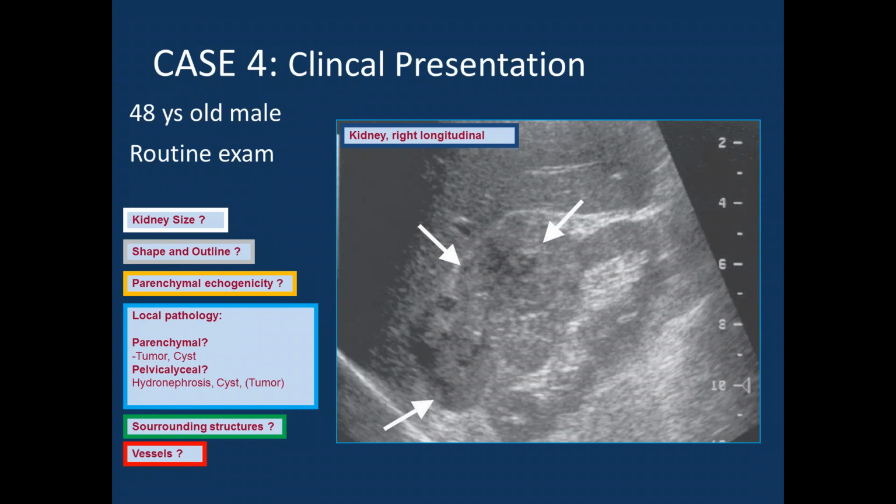Beside these huge lesions, in the ventral part of the kidney, sometimes it is difficult to tell exactly that the lesion comes from the kidney, because this is the area where we often see lesions from the liver, the kidney, or the adrenal gland, and that can be difficult. But in this case, it's a kidney lesion. And the criteria, we already had heard about cysts or benign lesions such as the angiomyolipoma. This is the classical benign lesion. What would be the suggestion here?